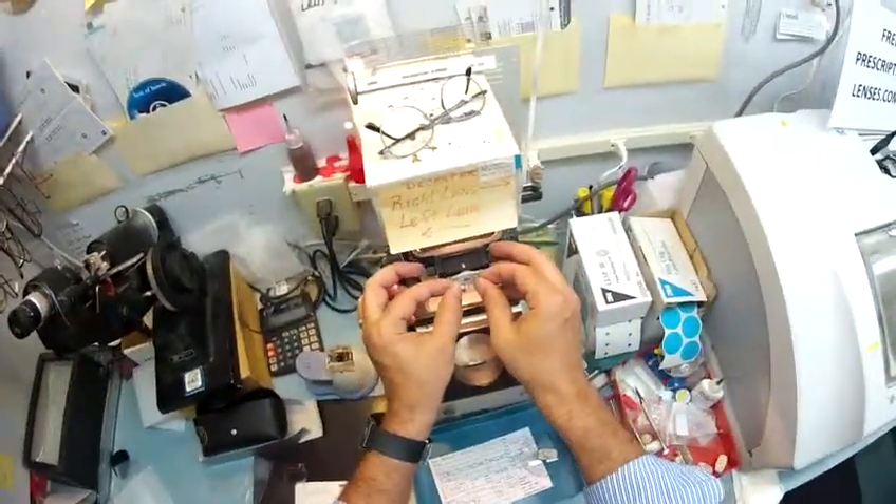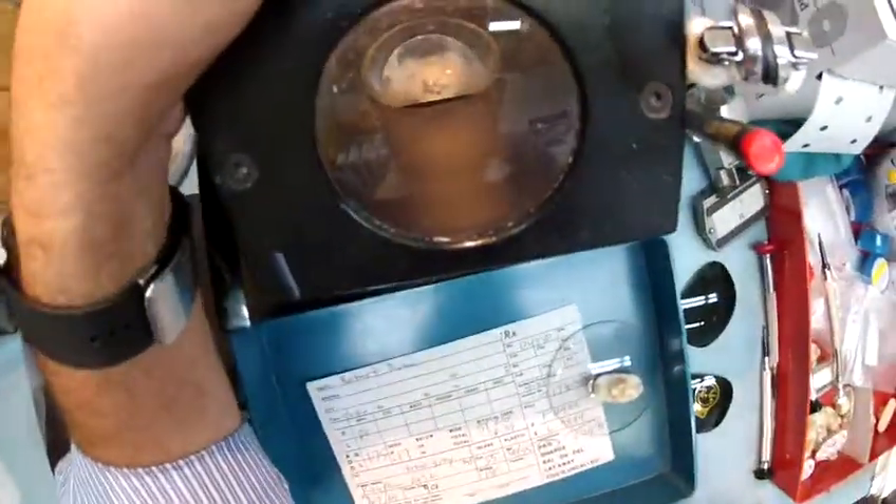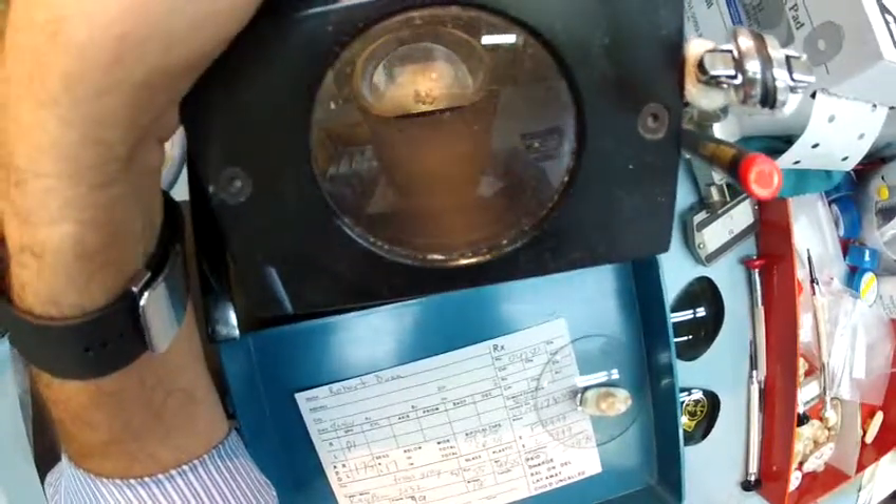There's no correction in the top — it is plano, meaning non-prescription — with a plus 1.75 in the bottom. I'm going to get everything lined up on this one, make sure the heights of both are matching, and we are good to go.